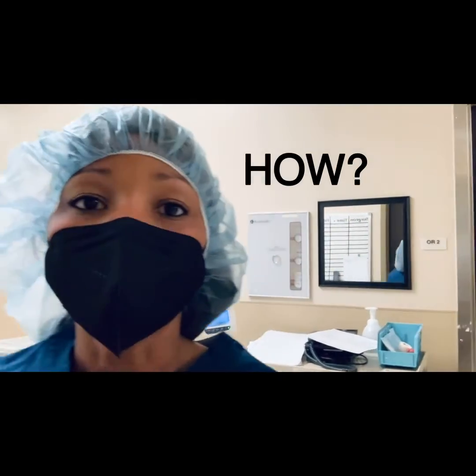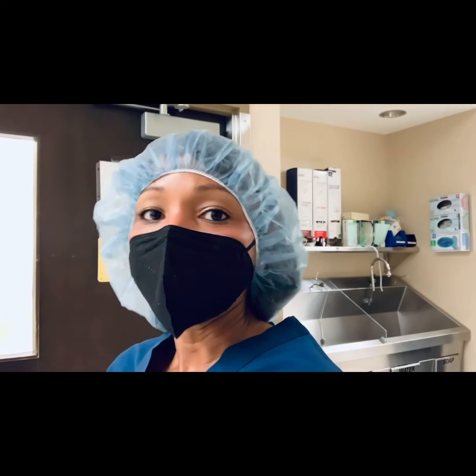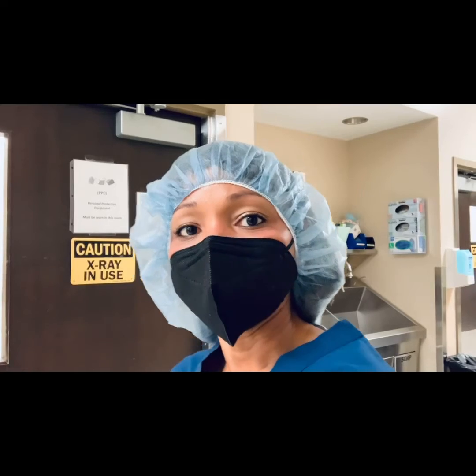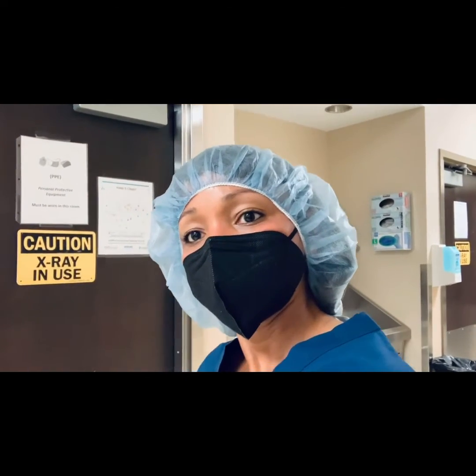Here we are, going into the operating room. I'm going to show you a setup using sawbones, and demonstrate the difference between the TPS and what the actual MIS instrumentation looks like and what it does.